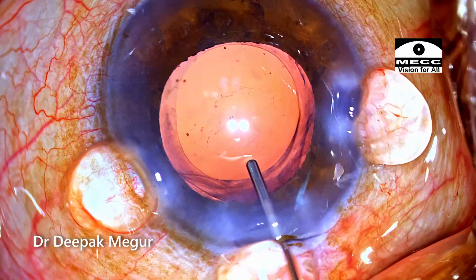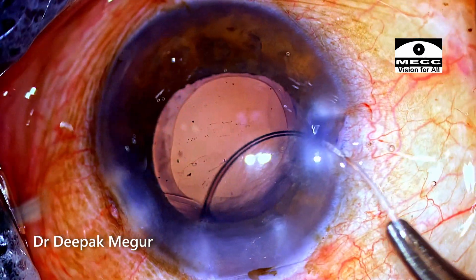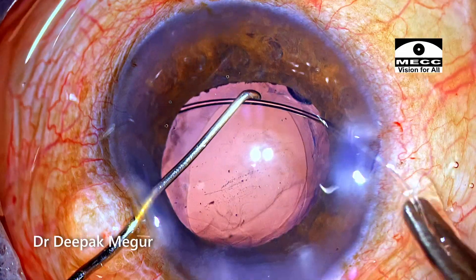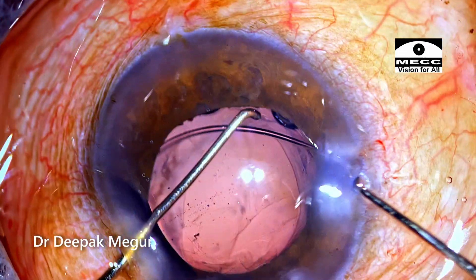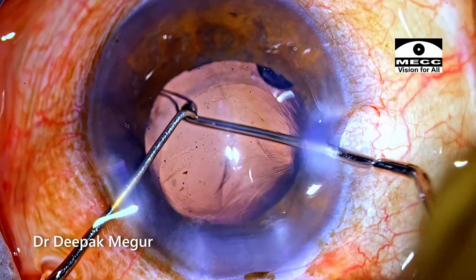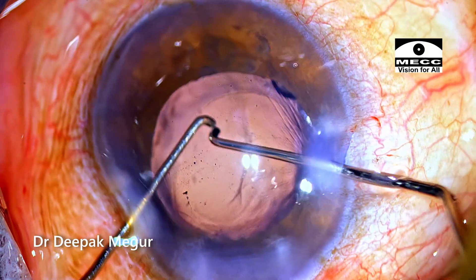The bag is inflated with cohesive OVD and the CTR is threaded into the bag. I always prefer to use a Sinski hook to push the CTR inside as it is being threaded, to minimize any stress on the zonular apparatus during insertion.